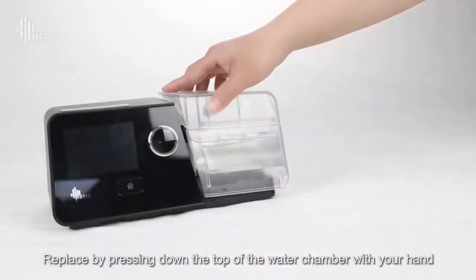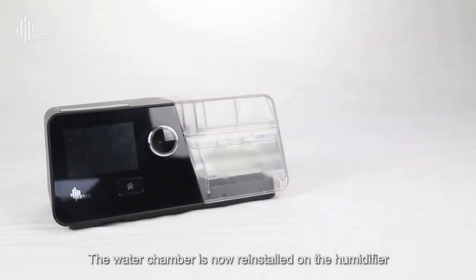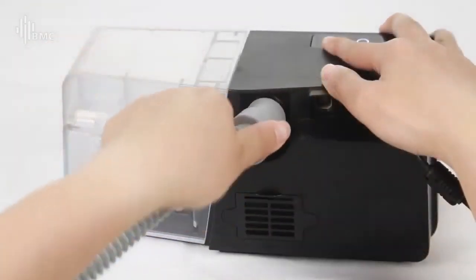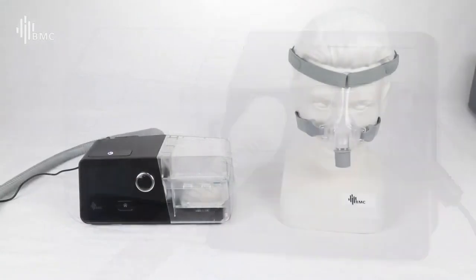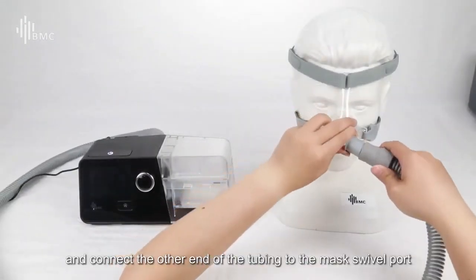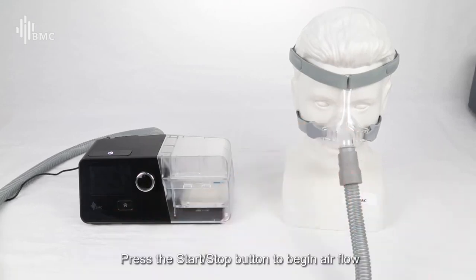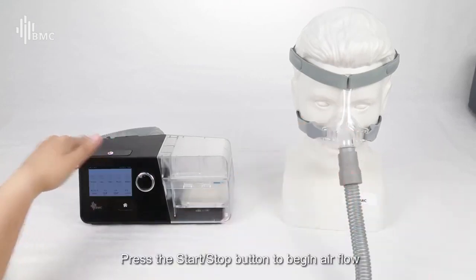Replace by pressing down the top of the water chamber with your hand. The water chamber is now reinstalled on the humidifier. Connect one end of the tubing to the device's air outlet. Put on your mask and connect the other end of the tubing to the mask swivel port. Press the start or stop button to begin airflow.